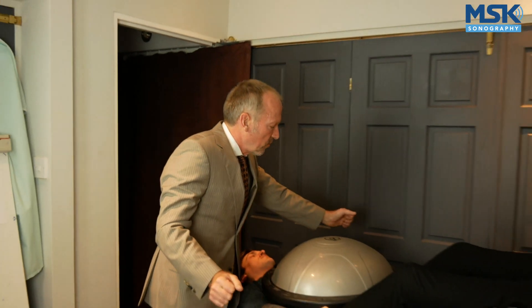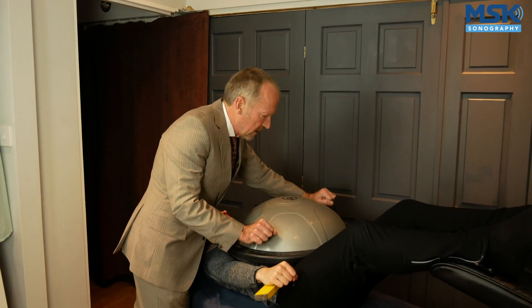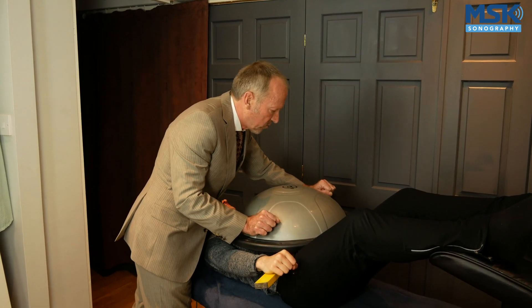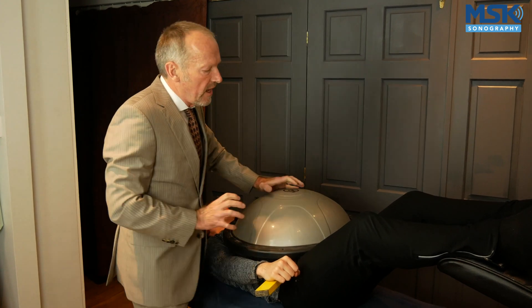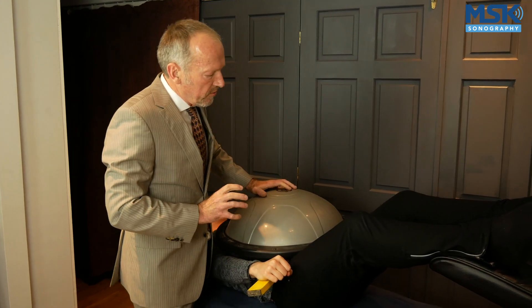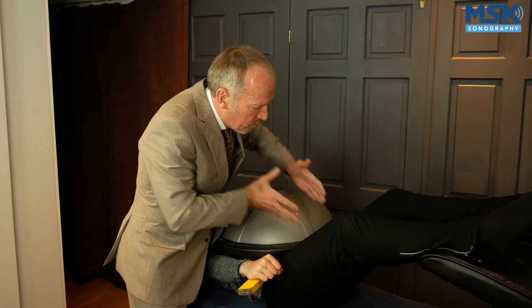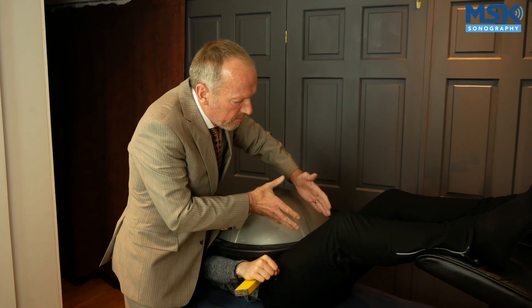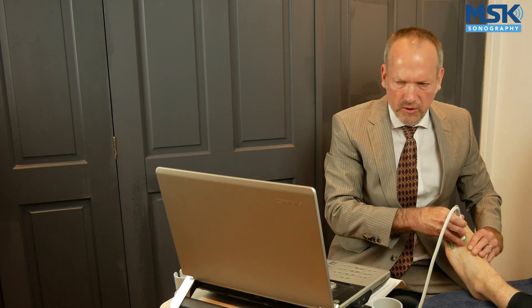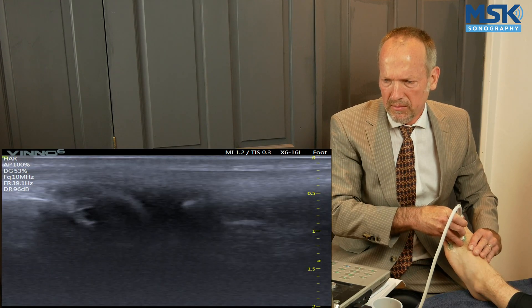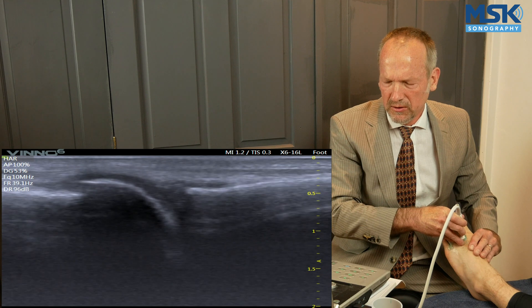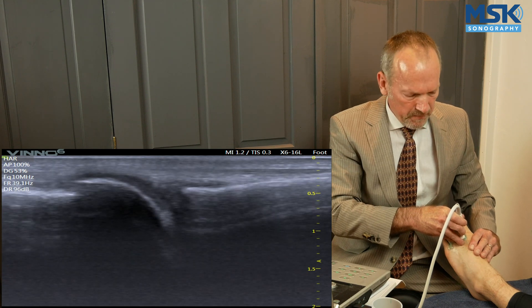That's what we're going to demonstrate in a moment. And from the Moulders test, if you squeeze the metatarsal heads together and there's bursal distension, the bursal fluid will push down through. So we're scanning on the line of the second metatarsal metatarsophalangeal joint now.